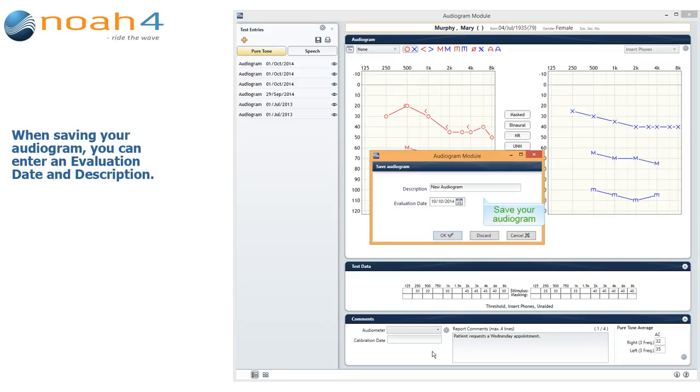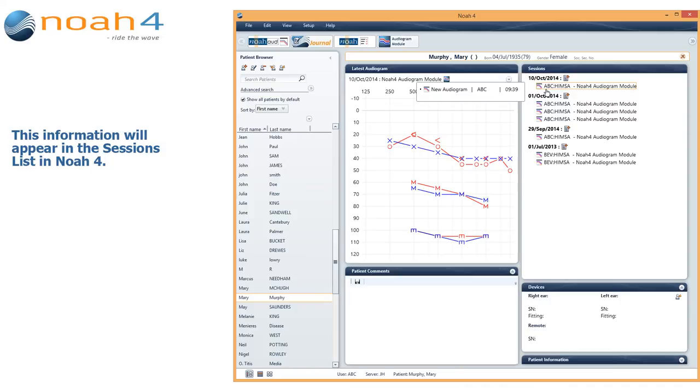When saving your audiogram, you can enter an evaluation date and a description. This information will appear in the sessions list in Noah 4.